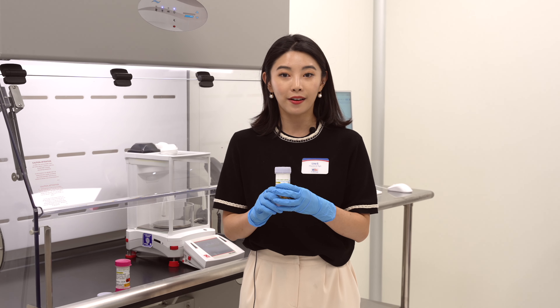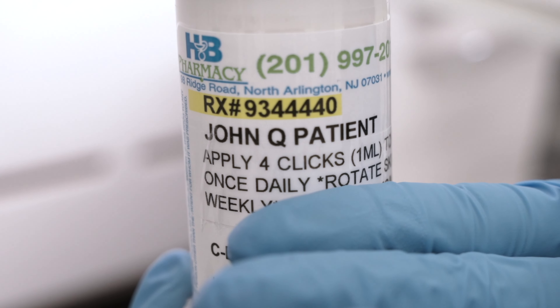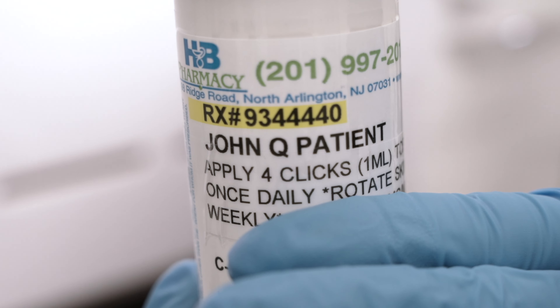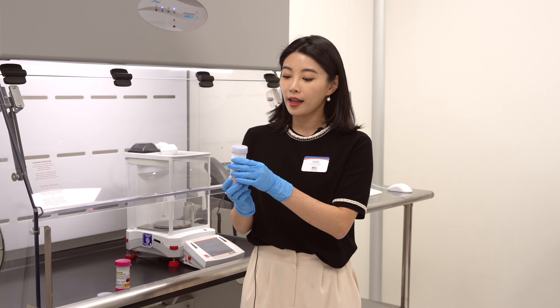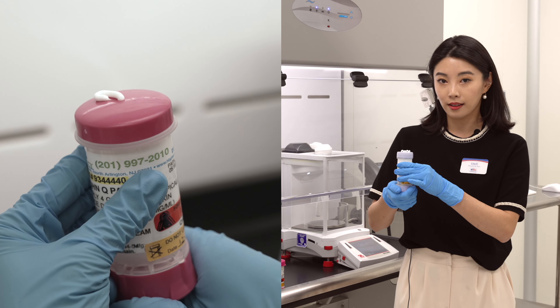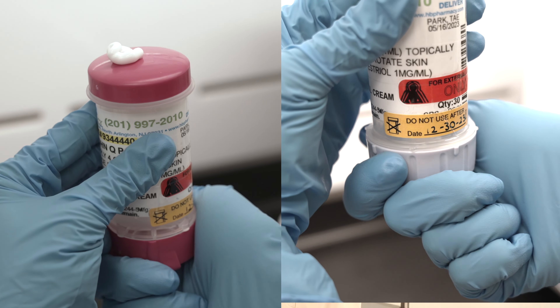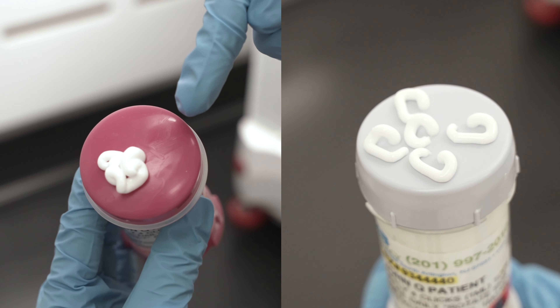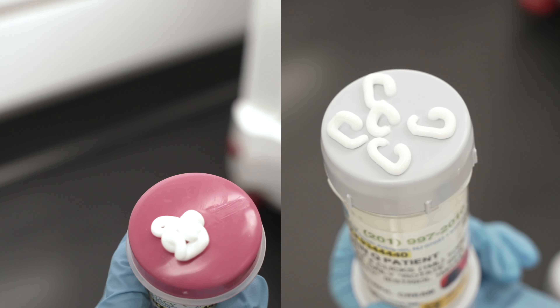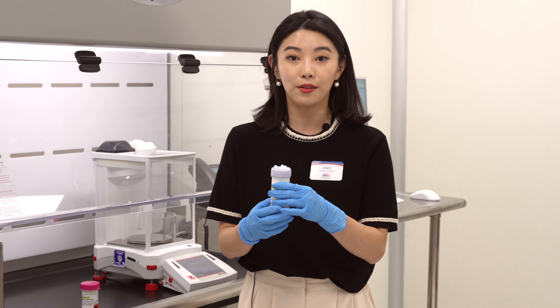Once you select the area, let's start with the clicking. As I said, you're going to be getting four clicks as per the label. Always read the instructions very carefully. I'm going to click it four times as written on the label to give me the dose that I need. Always make sure that cream is coming out evenly to ensure you have the right dose.